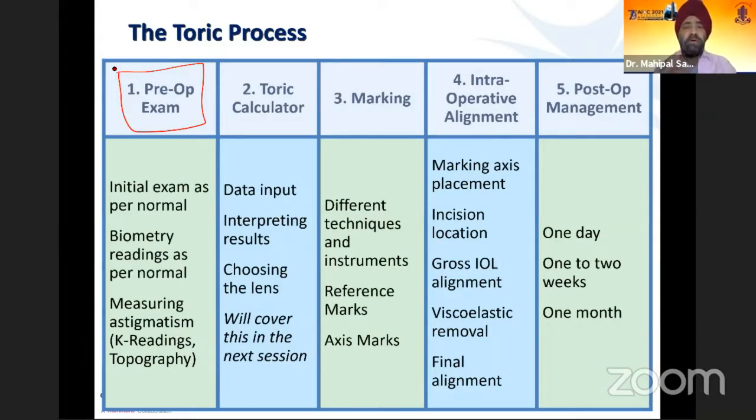If the cornea has been exposed to, say, xylocaine or paracaine drops, or tonometry has been done, or an A scan has been done and you have touched it, then the readings would not be good. The surface of the cornea needs to be optimized if we are looking at ocular surface disease, and only then should we do the keratometry.